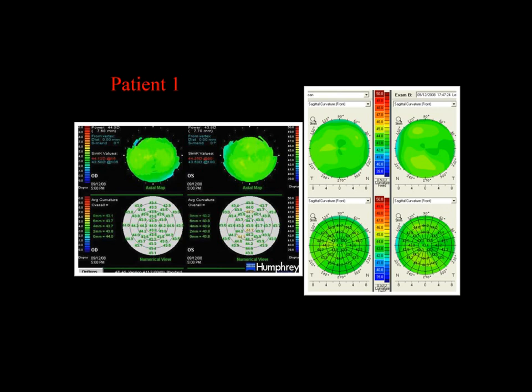One is Placidos have very limited coverage, and that's because they are reflective. So you'll rarely ever get as much corneal coverage as you'll see on a Pentacam. And here you'll see, this is just one example, the curvature map on your left from a Placido system, the curvature map on your right from the Pentacam. And what you will see, and I'm going to flip through these quickly, is that the information is clinically identical, except again you will see a lot more dropout on the Placido and less coverage than you'll get on a Scheimpflug.